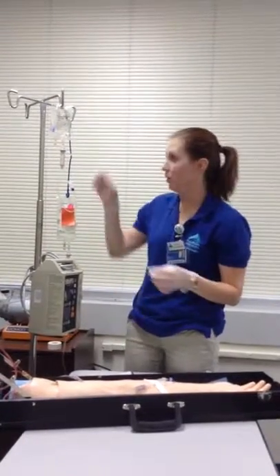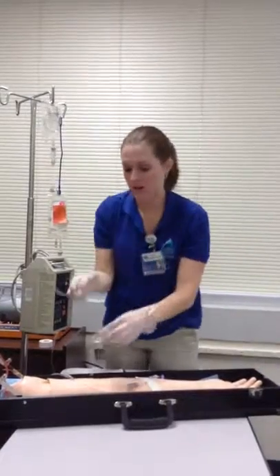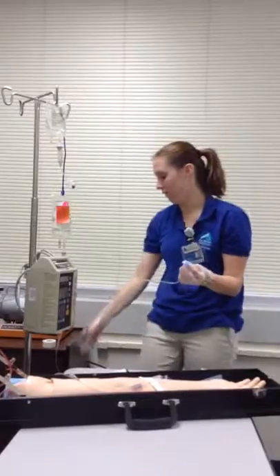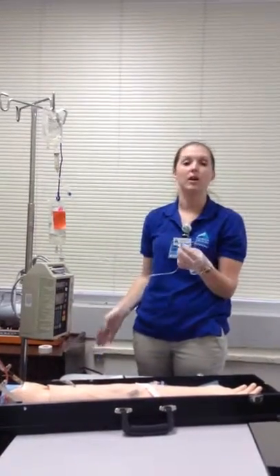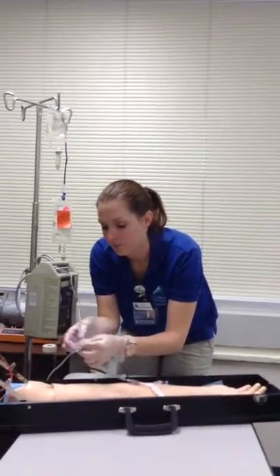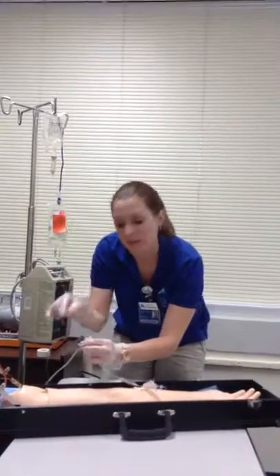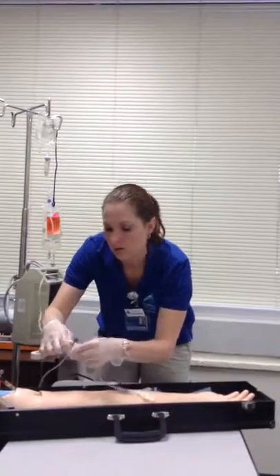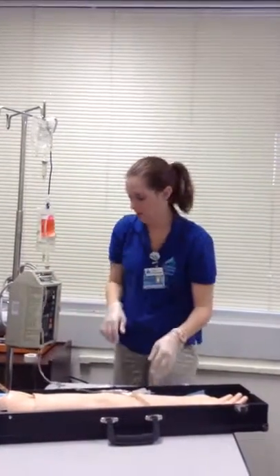I'm going to scrub the hub and attach my new medication. First though, I would have closed, I'm sorry, I would not have done that. I do that afterwards, sorry. If that was not clamped, I would have wiped that. Okay, that is now together.